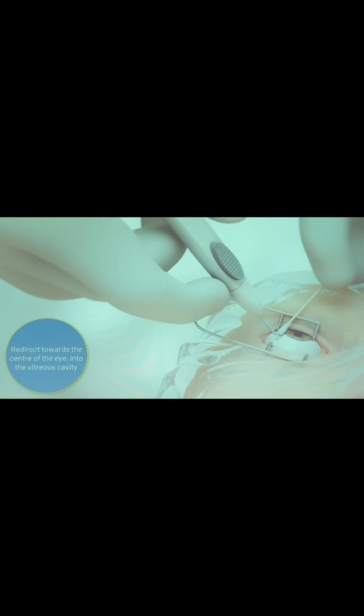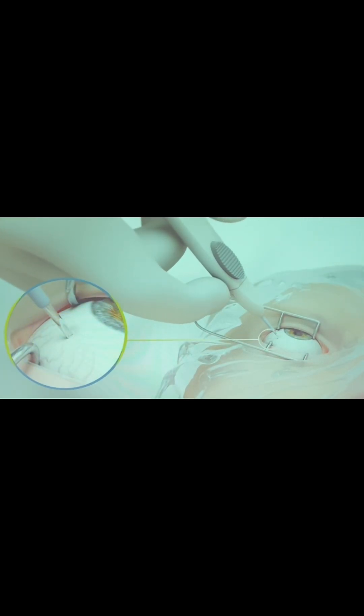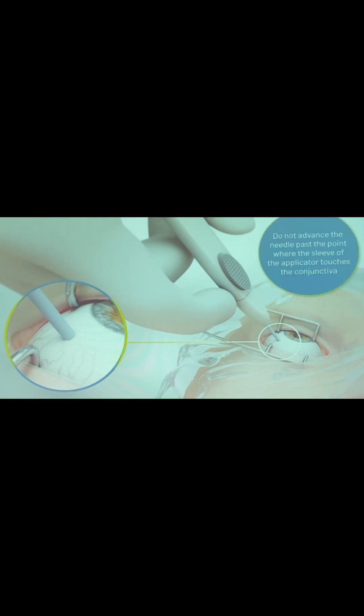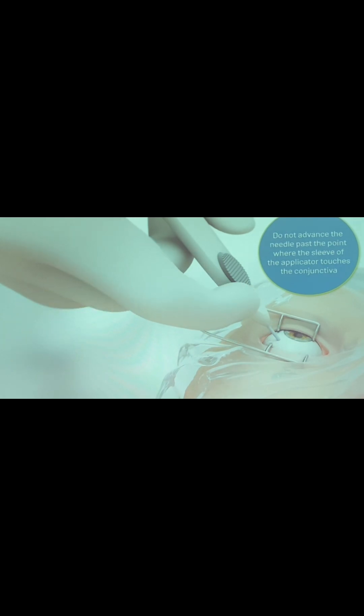Redirect towards the centre of the eye into the vitreous cavity. Advance the needle until you enter the vitreous cavity. Do not advance the needle past the point where the sleeve of the applicator touches the conjunctiva.